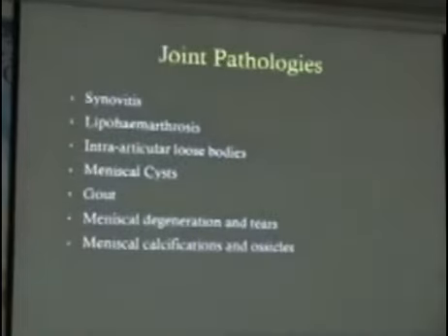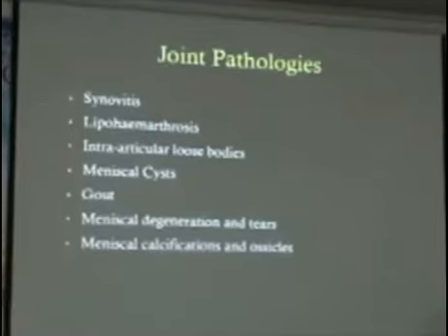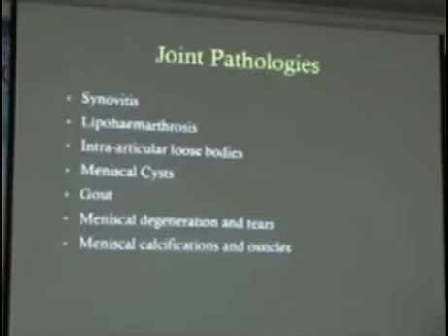So if we have a look at the knee joint itself, like any other joint, it's quite susceptible to synovitis. In the setting of trauma, we can have lipohemoarthrosis. It can have loose bodies. We can see meniscal cysts and also gout.